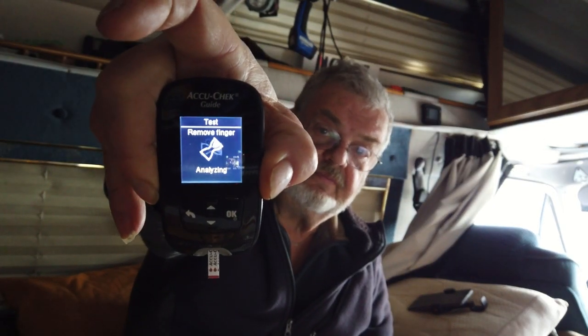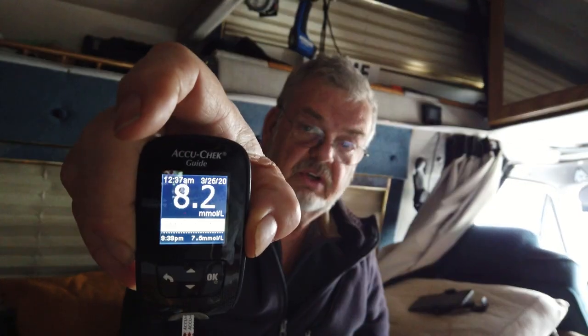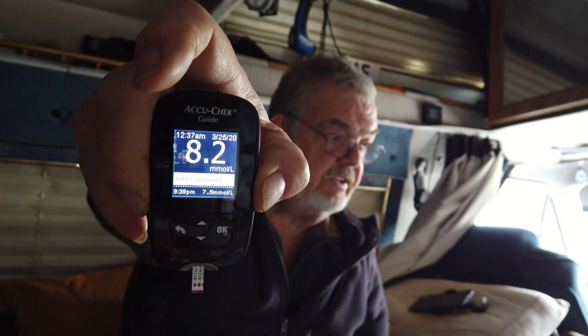Alright guys, it's two hours after eating breakfast. Let's take a readout and see if we got blood in this finger. Ouch — they've got it set too deep, going into the bone! Okay, two hours after a meal: 8.2. Anywhere between 7 and 10.5 is good, so 8.2 is excellent for a diabetic. Incredible!